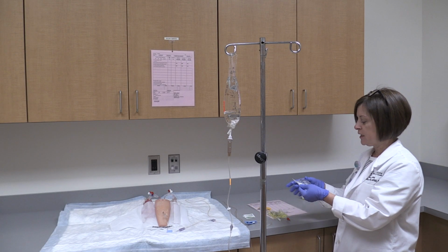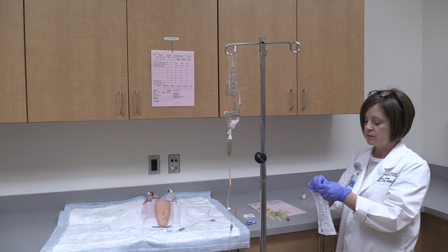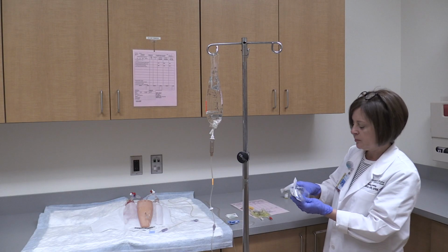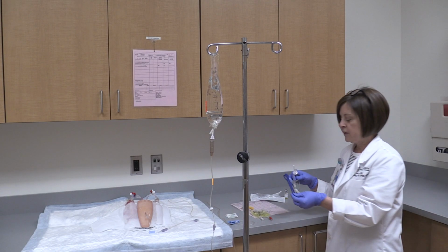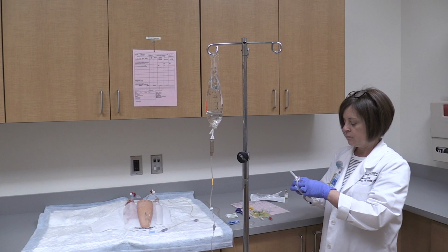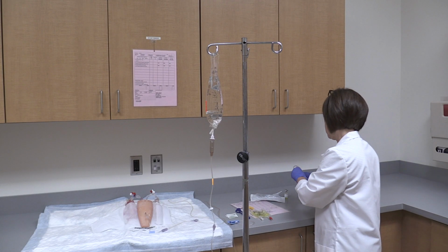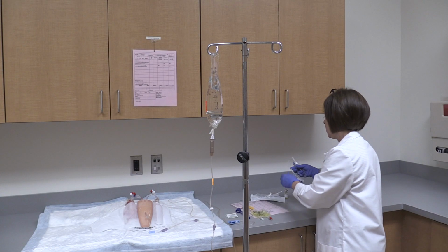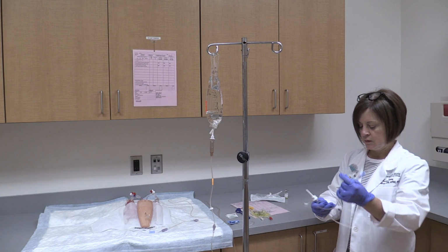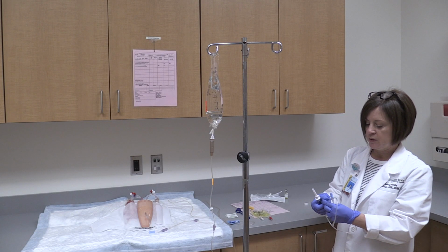I'm going to go ahead and take out my secondary tubing. These bags typically have a perforation on the edge to make them easy to open. In there I have a hanger and my tubing. And I want to check my tubing to make sure it looks good, there's no kinks, and I want to clamp it before I spike.